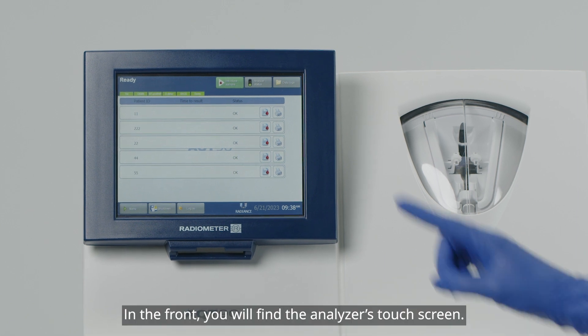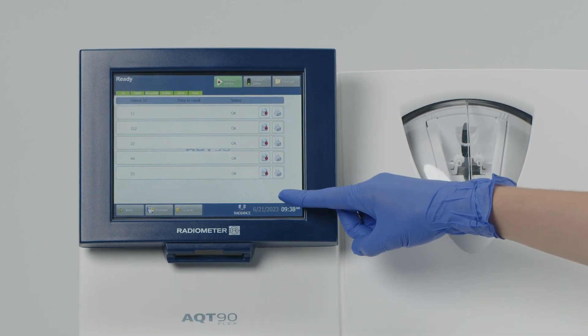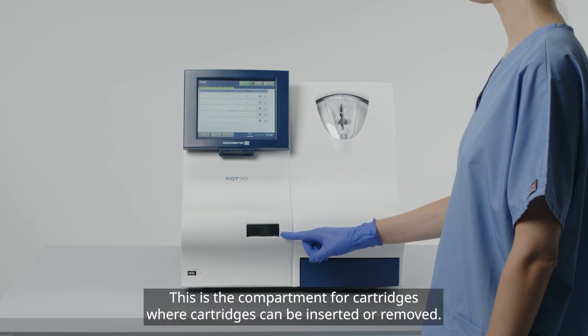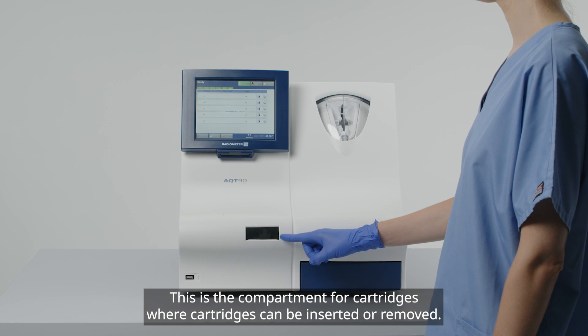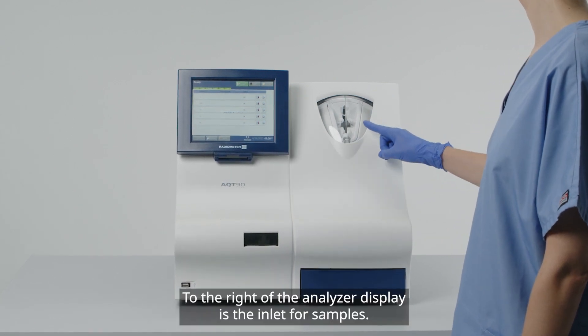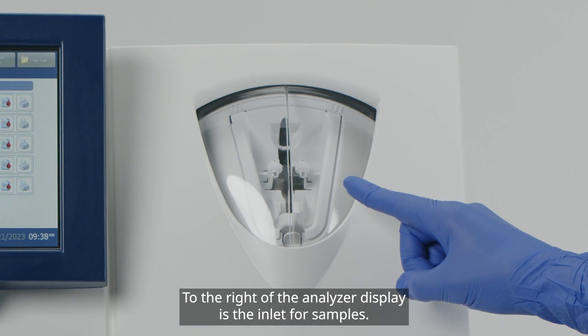In the front, you will find the analyzer's touch screen. Below the screen, there is a barcode reader. This is the compartment for cartridges, where cartridges can be inserted or removed. To the right of the analyzer display is the inlet for samples.